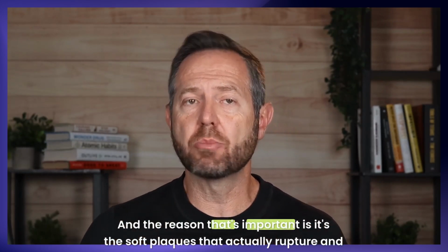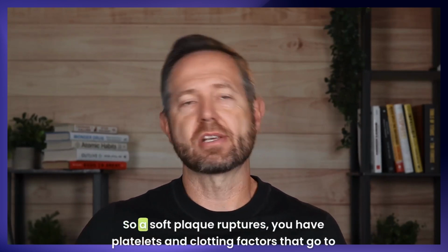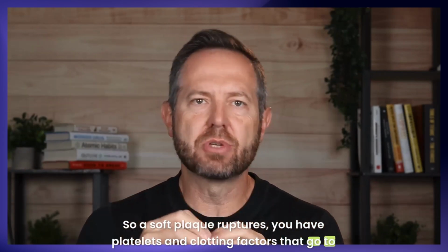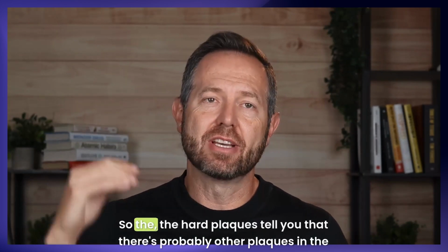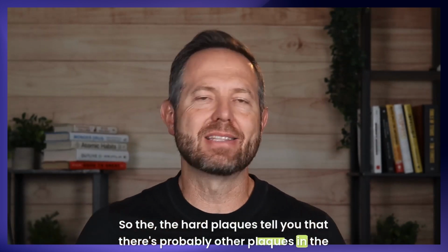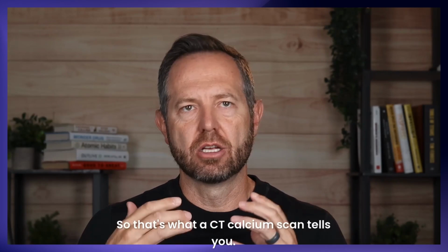And the reason that's important is it's the soft plaques that actually rupture and cause heart attacks. So a soft plaque ruptures, you have platelets and clotting factors that go to the site, they form a clot, it blocks up your artery, you have a heart attack, okay? So the hard plaques tell you that there's probably other plaques in the neighborhood. So that's what a CT calcium scan tells you.